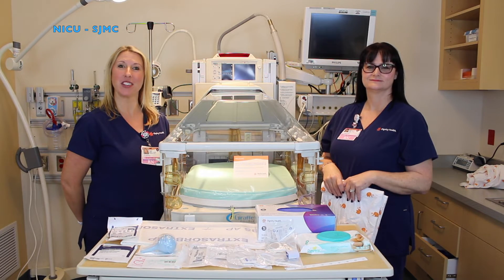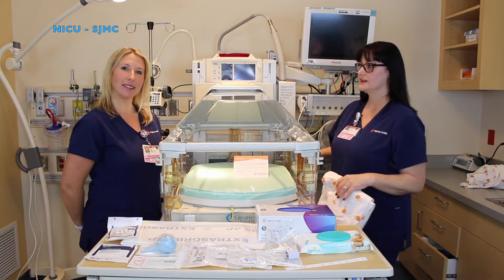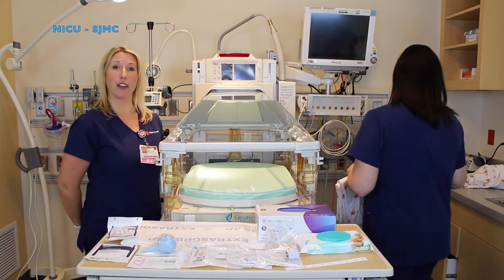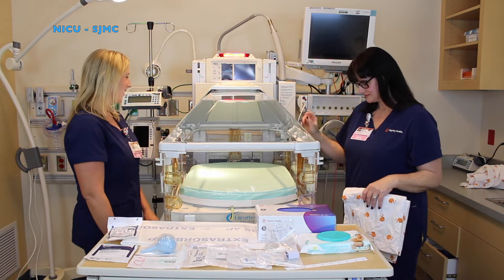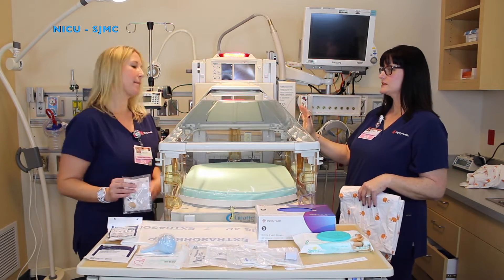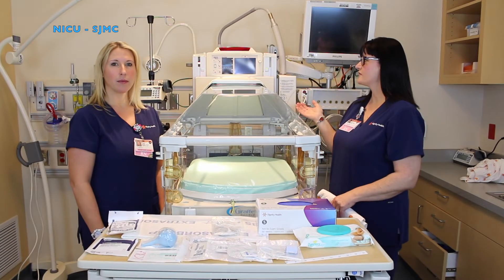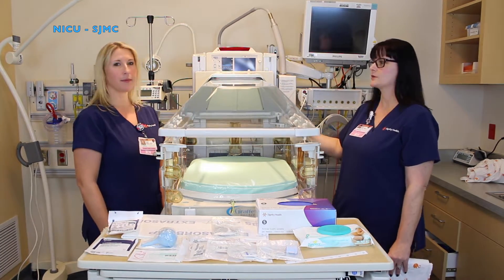Today we're going to show you how to set up an admission bed. First you're going to start with a clean giraffe. How you know your giraffe is clean is you're going to look for the little card that the housekeeper puts inside the bed. Then you will turn on your giraffe — the button is back here. To open the canopy of the giraffe you're just going to step on the canopy release. You're going to wait for the bed to warm up. Once your giraffe bed has finished its internal checks and it's ready to use, you can release the canopy by pressing the canopy release.